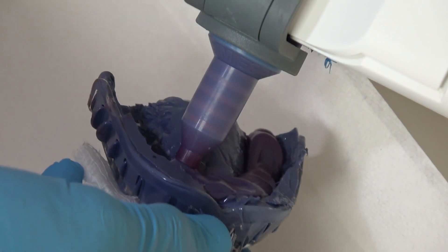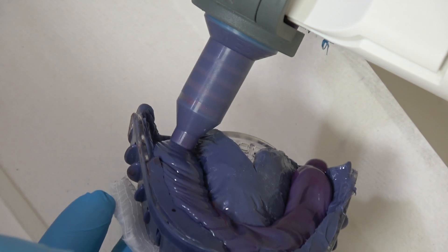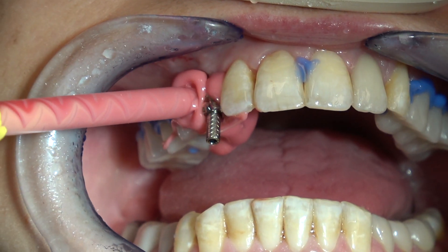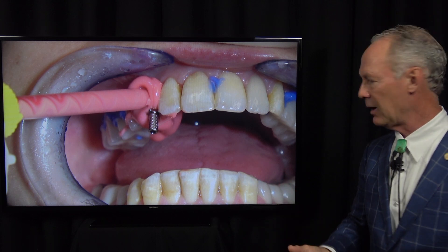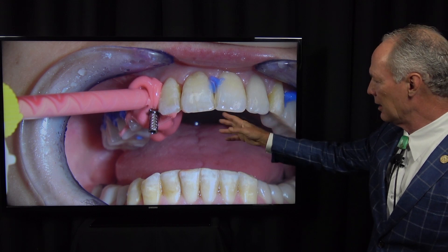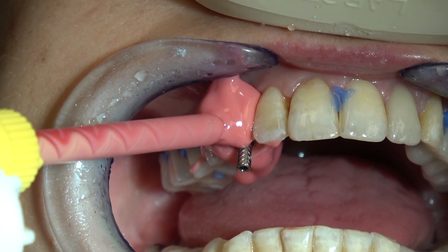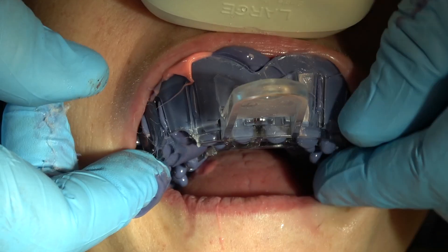Now I'm squirting the polyether into the custom tray — you can refer to the Dental Minute videos on how to take a polyether with custom tray impression. I'm squirting the wash material around the impression coping and into the custom tray as well.